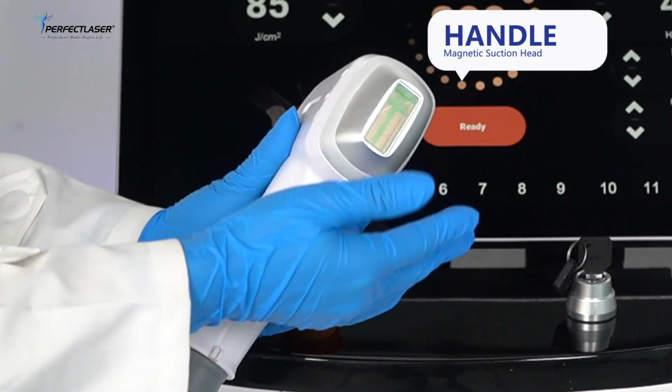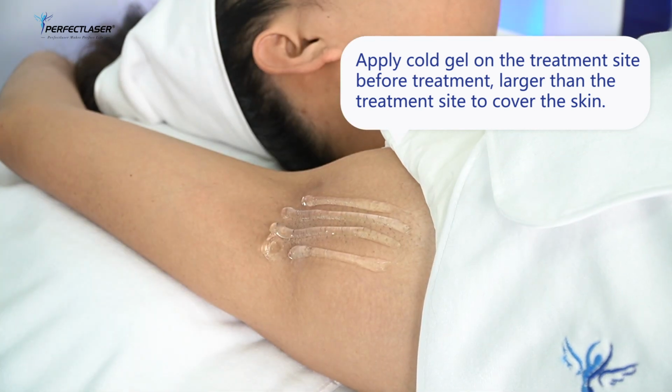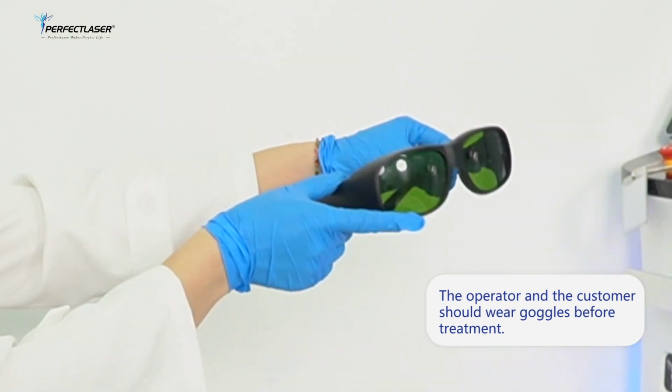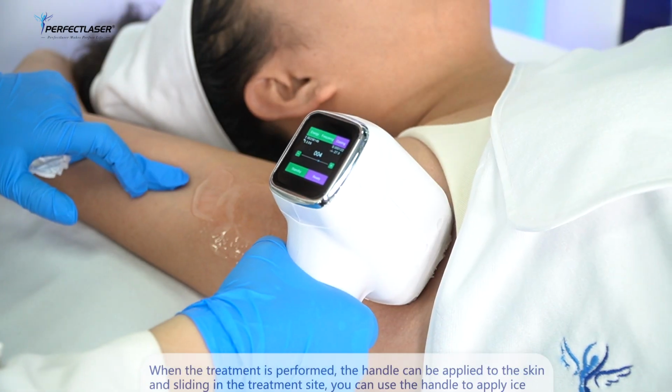Install the treatment head and apply cold gel with a thickness of 1 mm, which should be larger than the treatment area. The operator and the customer should wear goggles before treatment. Prepare for operation. The handle screen can be used to adjust parameters directly. Click Ready to start treatment.